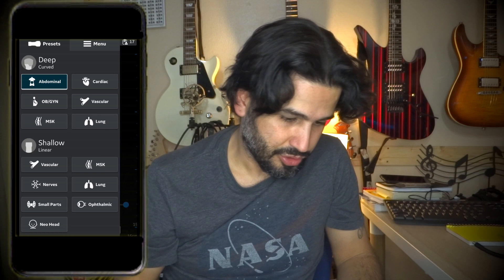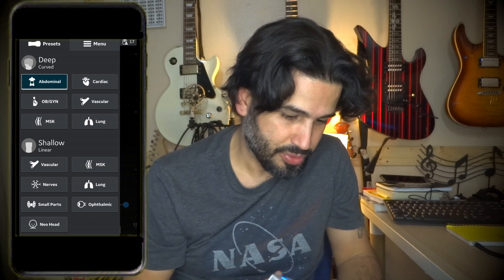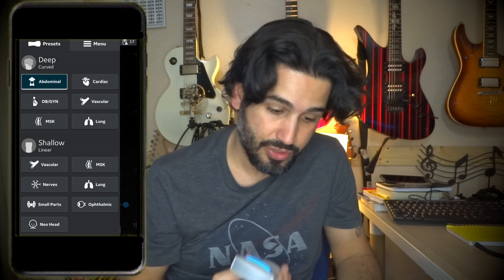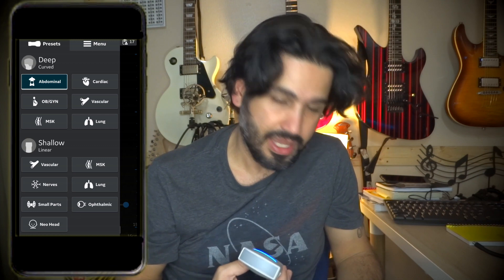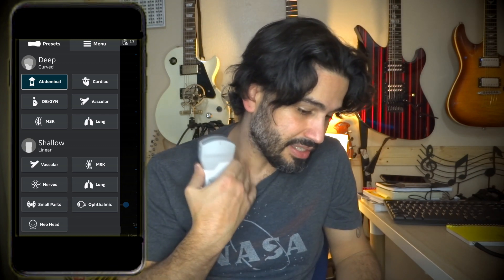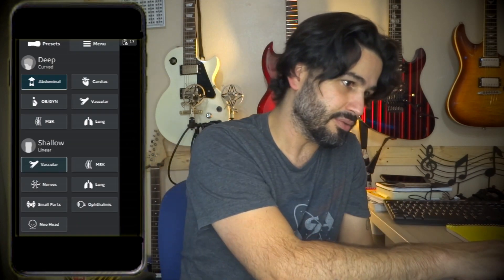I got the V-scan to demo, which is from GE. There are two probes: the curved probe on this side and a linear probe on this side. I'm going to take it for a quick test drive on my neck vessels. On the app, the curved probe has abdominal, cardiac, OB/GYN, vascular, MSK, and lung. The linear probe has vascular, MSK, nerves, lung, small parts, ophthalmic, and neonatal head. Since I'm doing a neck and looking at vessels, I'll choose vascular — MSK would probably be fine too.